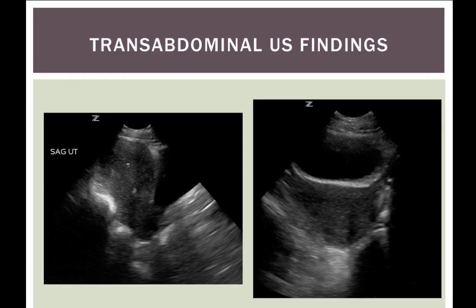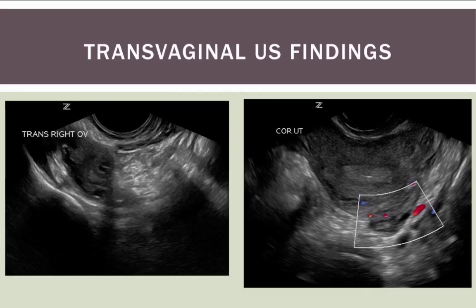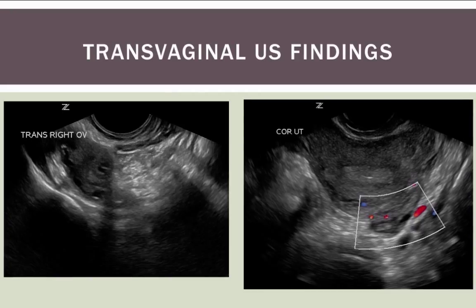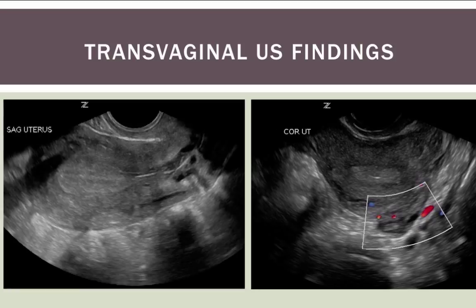Transabdominally, we don't see that much. No significant free fluid, no obvious masses in the adnexa. Transvaginally, our right ovary and left ovary look pretty normal. We don't see anything within the uterus.